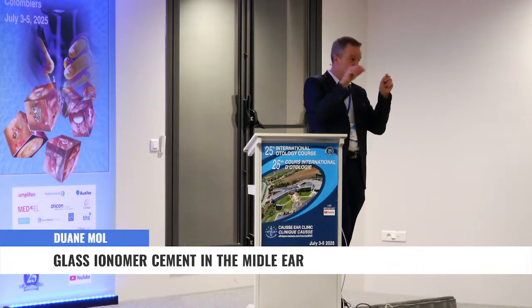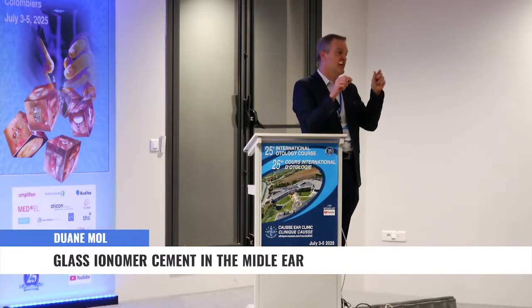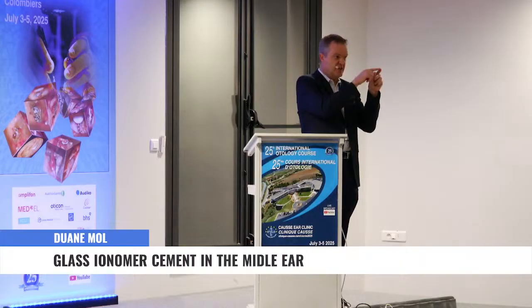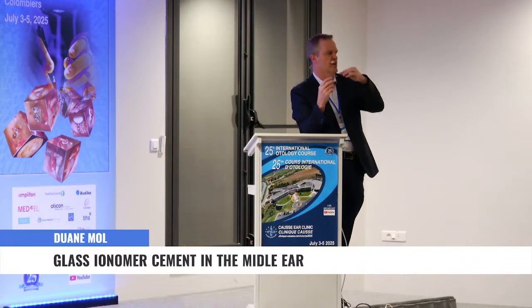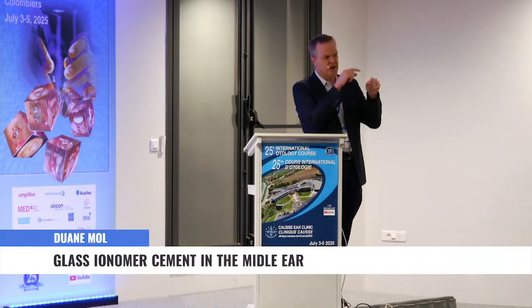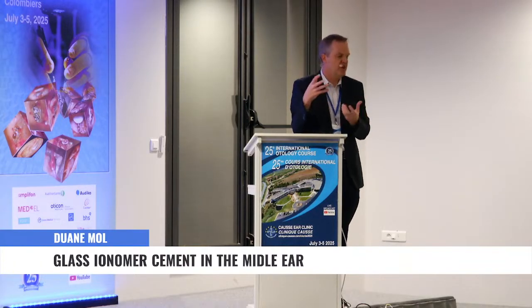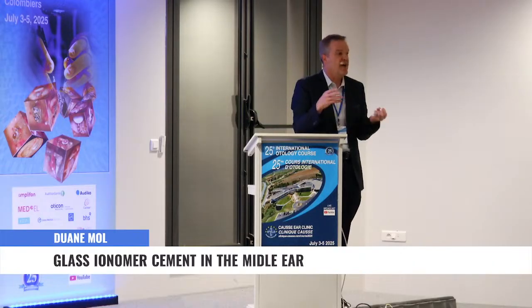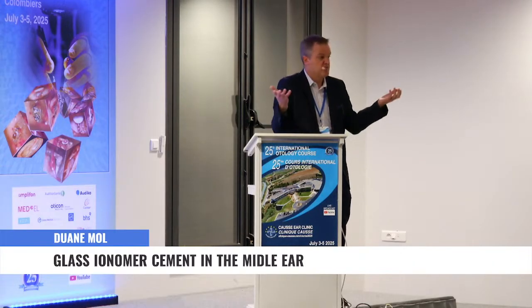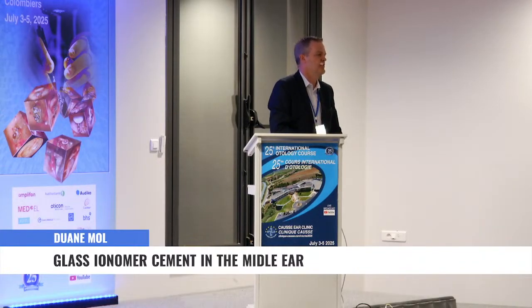And so if I do reconstruct that, inevitably, if I'm doing the lenticular process, very seldom can I fix from the incus body, and there's a small piece of lenticular process with a joint, and I'm just going to fix the incus. No, I inevitably include the joint in the encapsulation of the cement. And yes, it probably will be a problem, but if you think about it, it then acts sort of like the prosthesis does, that just sits on the head of the stapes. We haven't seen erosion of the stapes, but it's possible. It is difficult to get it dry, but it sticks quite well there.